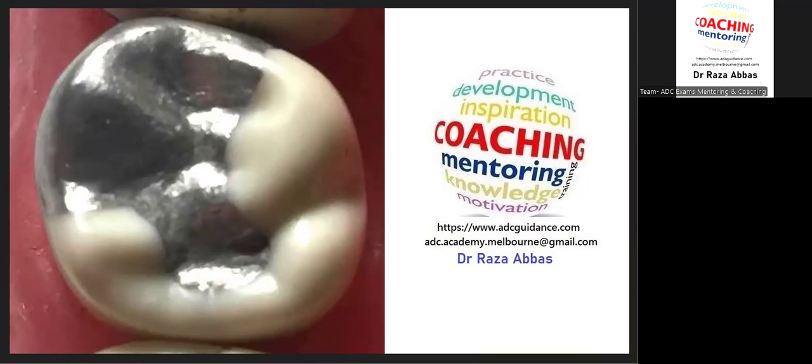Okay. Key components to look for, very important key components that decide on failure or passing this task? Number one, contacts. Your contacts need to be good. Your cusp position, your tooth restorative junction, very important. Your tooth restorative junction is very important. No gaps, no ditches. Okay.